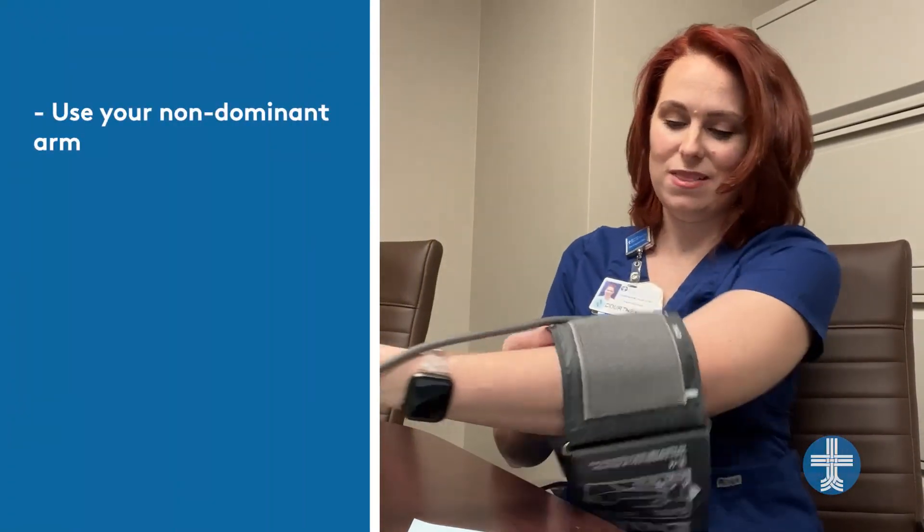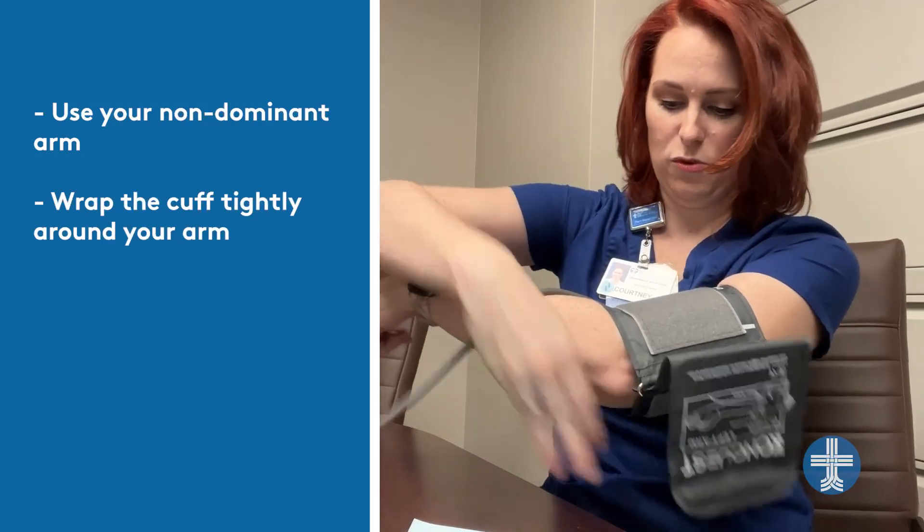So let's have an example of how to take your blood pressure at home. Some cuffs will have an arm cuff, like this one, and others will have one for your wrist. Pick up whichever one you prefer at your local pharmacy. It's best to try doing your blood pressure on your non-dominant arm — for me, that's my left. Go ahead and get it as tight as you possibly can so that it will be accurate.